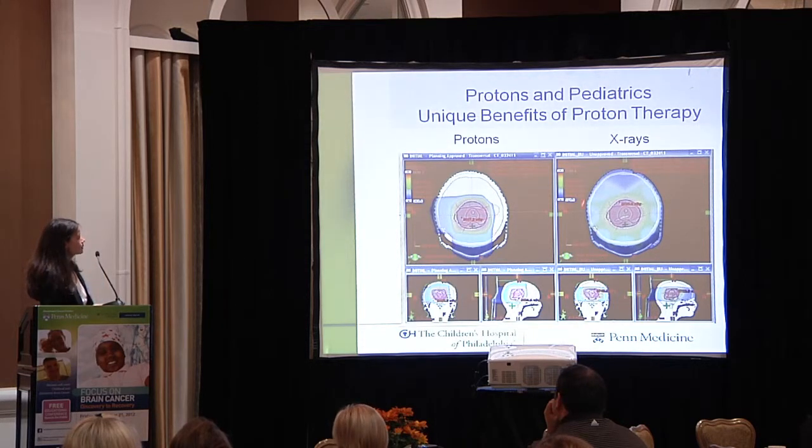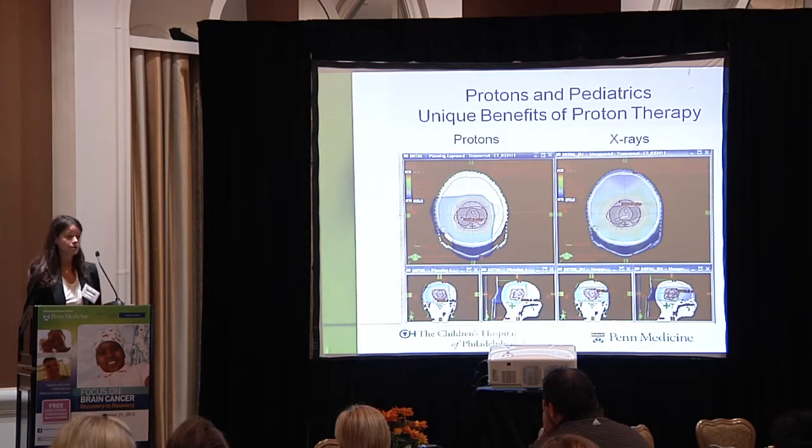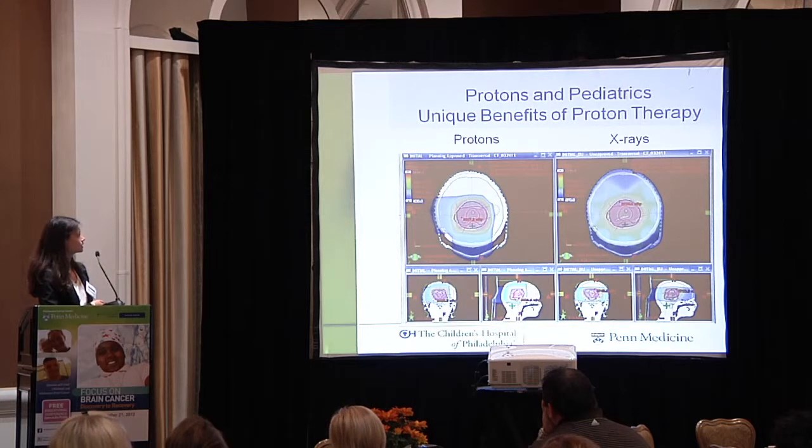When we use an X-ray plan, there's a low-dose radiation bath that's being given to the whole brain, and our concern is, number one, that this can impact IQ and functioning, and also that it may increase the risk of cancers that are actually induced by the radiation treatment. So we're very happy to be able to reduce the radiation exposure as much as possible, especially to very young children.